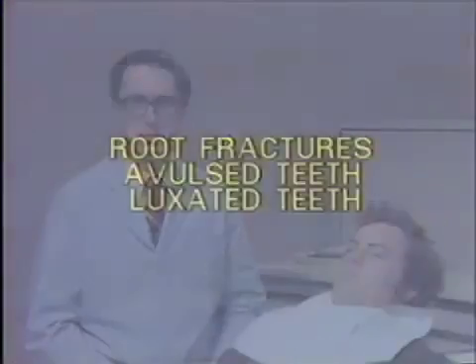Occasionally we find it necessary in dentistry to splint teeth that have been traumatically injured. Unfortunately, most of us don't have an in-depth knowledge of the technique of putting on orthodontic bands or using wire ligatures. Today we'd like to demonstrate a technique for splinting teeth using composite resins. The reasons for splinting could be many: the tooth could have sustained a root fracture, it could have been avulsed and replanted, or it could have been luxated and moved back into position. In all cases it's necessary to splint these teeth to retain stability and increase the chance of a better prognosis.